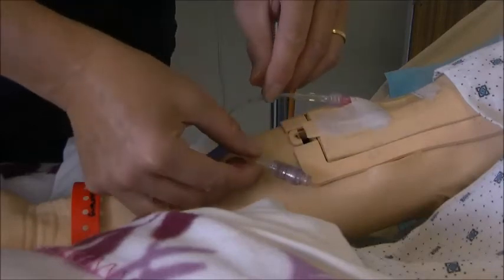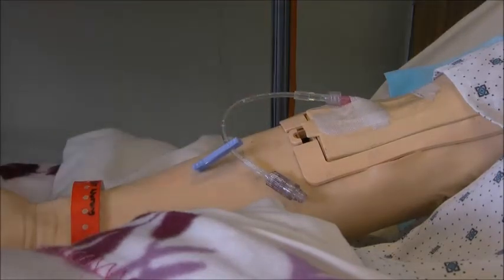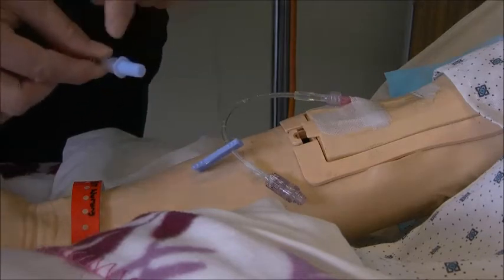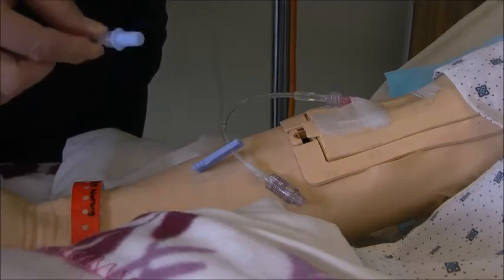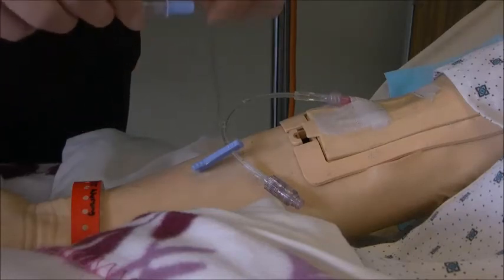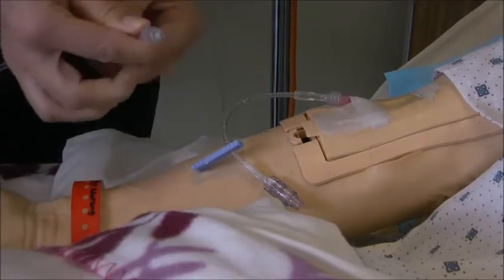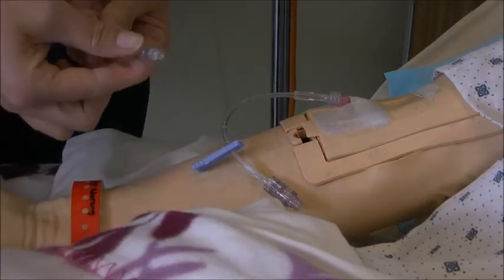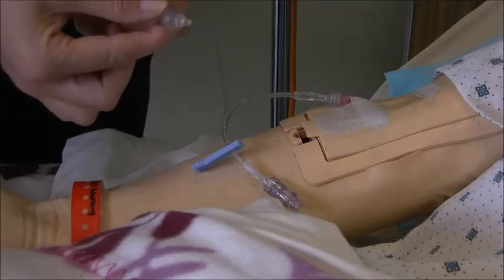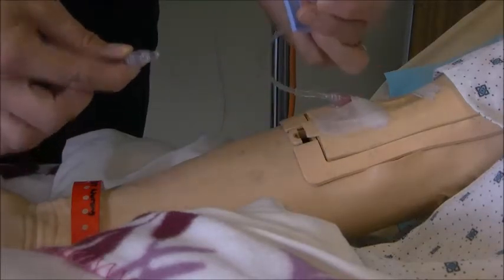And I don't want it to touch anything, so I'm really careful about where I put it down. And then this is the end of my tubing, and this is a cap that's keeping everything sterile underneath, so that is what I want to connect to this tubing. When you take this blue cap off, you'll find that it has a male end on it, so that bit that's sticking out, with a luer lock cap here, and that is what will secure it to the interlink connection there. So you pick it up without touching it.